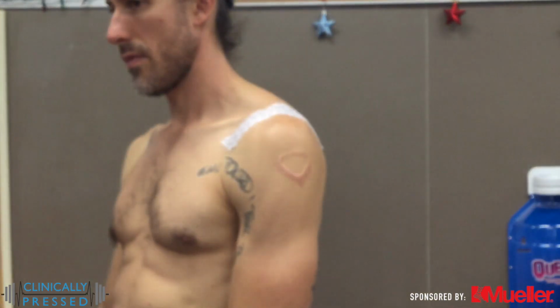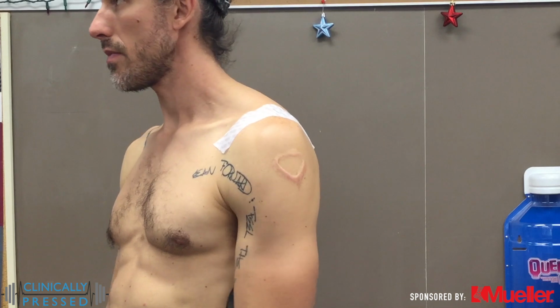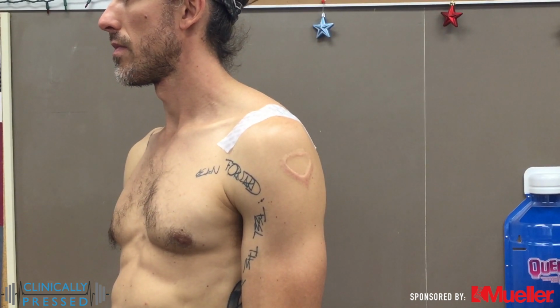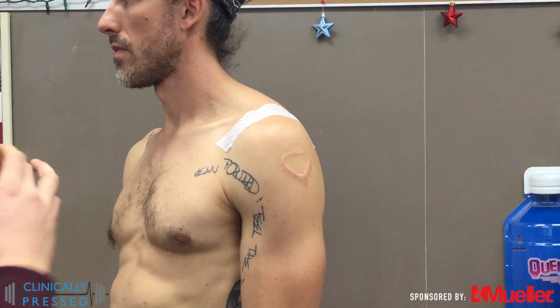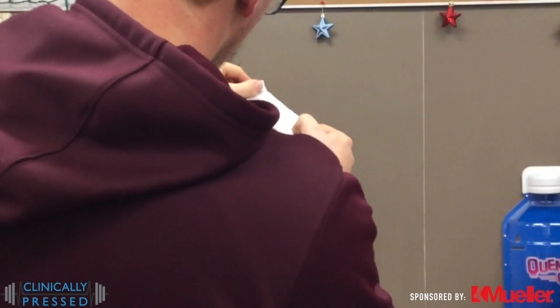So this is just another view to give you another angle of what it looks like in terms of applying all those things. One thing to note here is with those pro strips, you could potentially round the edges just to stop from any catching or bringing up the edges for a longer lasting application.